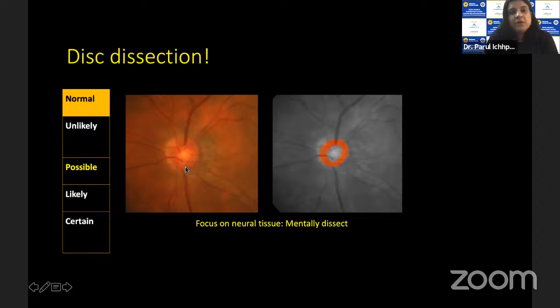And remember, we don't have to fall for the color of the cup. We have to follow the contour of the blood vessel that is there on the optic nerve head. So color cupping is not what we need to document. We need to document the contour cupping following the blood vessel. And once we do that, then the actual size of the cup comes.